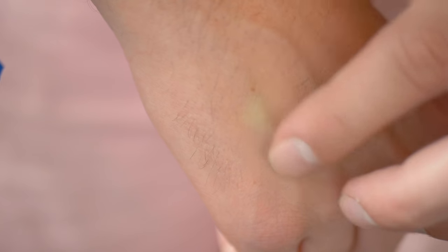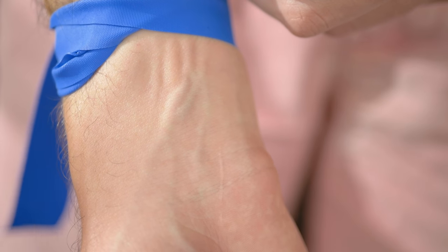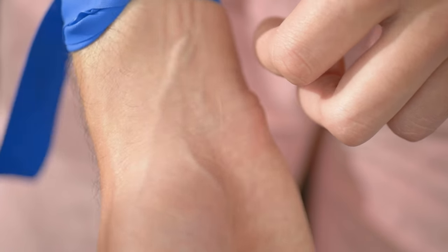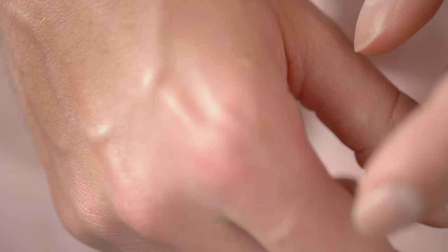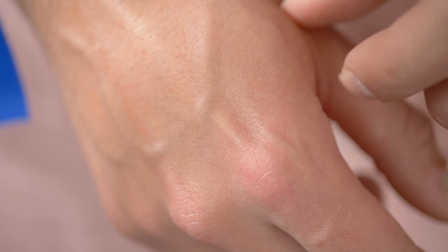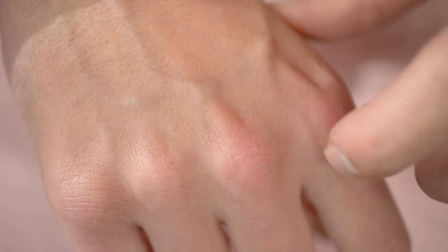Hand veins can be good, but they can also be pretty superficial and easy to see in older people, yet might not take a catheter well. If they're very dark blue and move around easily with tissue-paper-thin skin in an older person, they are probably going to be easily blown — be gentle with them. The underside of the forearm near the wrist is more of a last resort. Finger veins are truly a desperate option, but they can be surprisingly durable — look along the sides of the knuckles, because that's where they hang out.